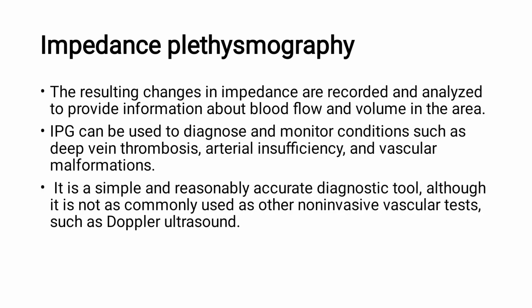Here we are using the electrodes and we are passing a small amount of current. Then the changes in impedance will be measured in accordance with the volume changes in the body.